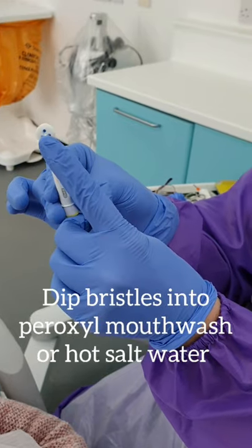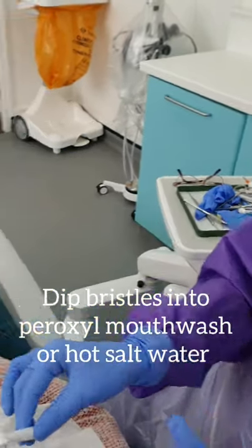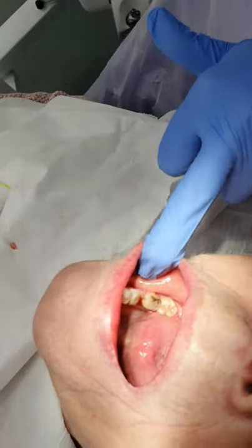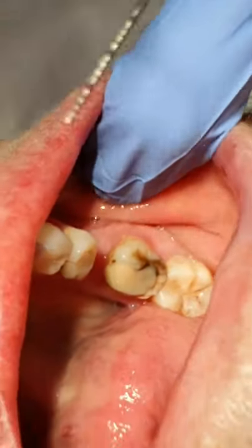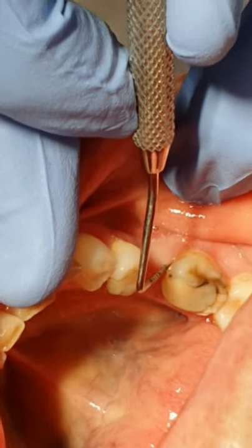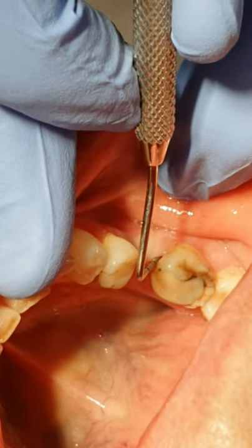You can dip it in salty water or mouthwash and the aim is to work it into the pocket. So we're just going to have a look in this patient's mouth. This lady's got a pocket just on the front of this molar. You can see they've got a gap here, and just at the front of the tooth there it just dips all the way in — it's a good eight millimetres down.